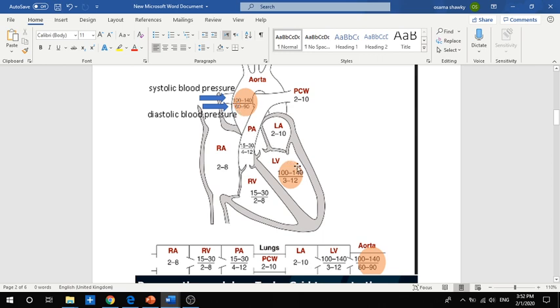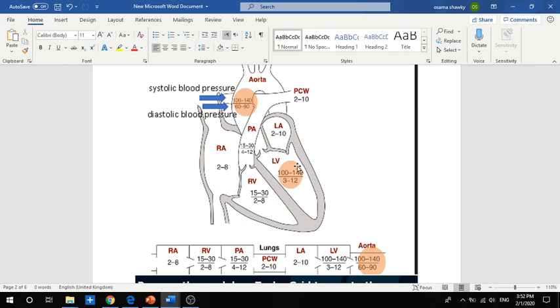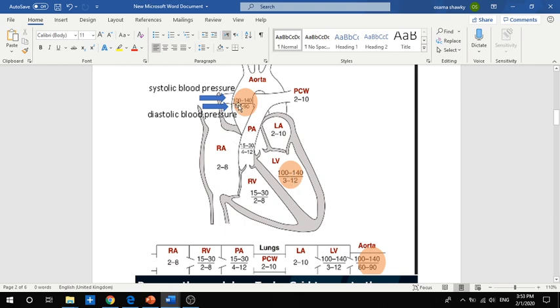Now we need the flow rate. Based on previous studies, we know that the human heart flow rate is between 4 and 5, maybe up to 6 liters per minute, with a maximum value of about 7 liters per minute. We take the design point Q and head, so Q will be 5 liters per minute and head will be 120 millimeter mercury.